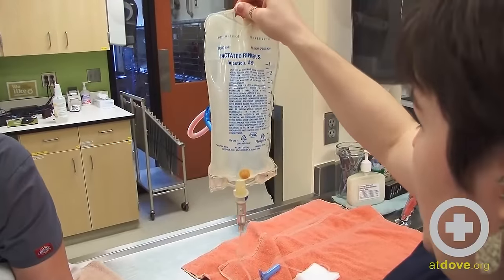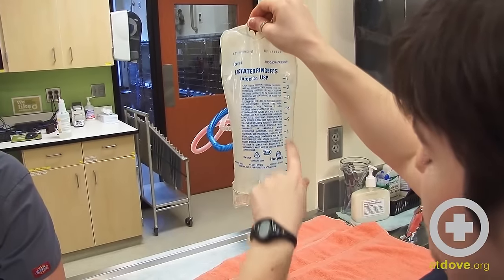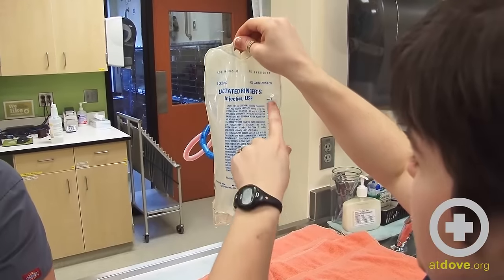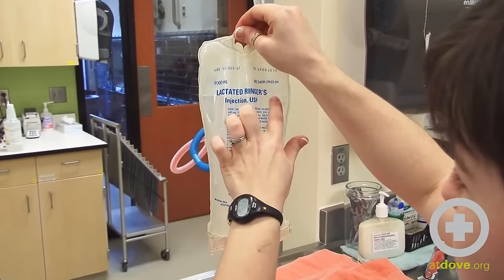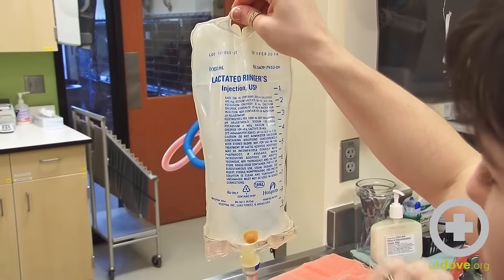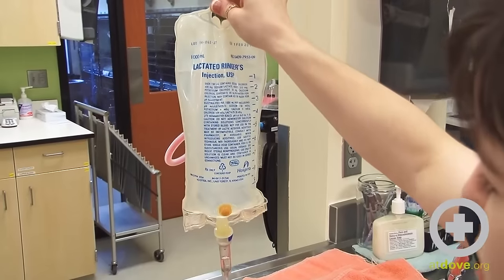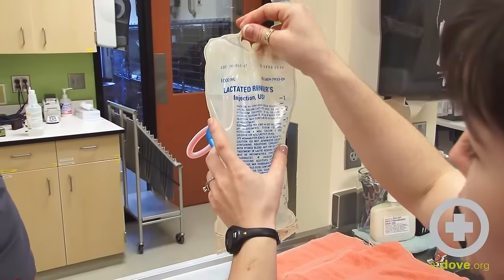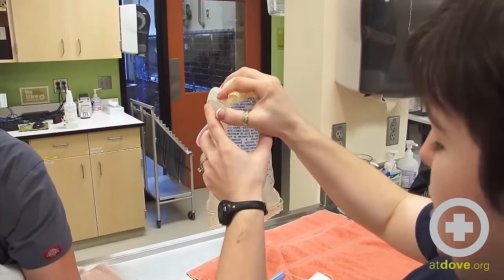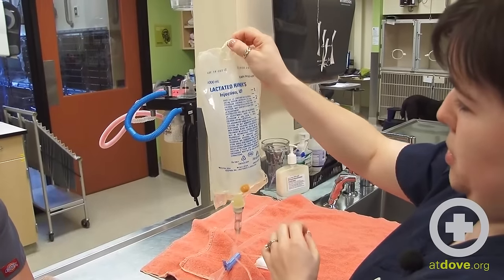With the bag free-hanging you can see that this 1,000 ml bag has markers down the side that divide 100 mls. Since this kitty is going to be getting 100 mls of fluid, we need the fluid level to get down to the 100 ml mark. If you're holding the bag it can change how it looks, so you want to make sure it's hanging when you're reading it. If you are squeezing the bag, check periodically to make sure you are not going past how much fluid the kitty is supposed to be getting.